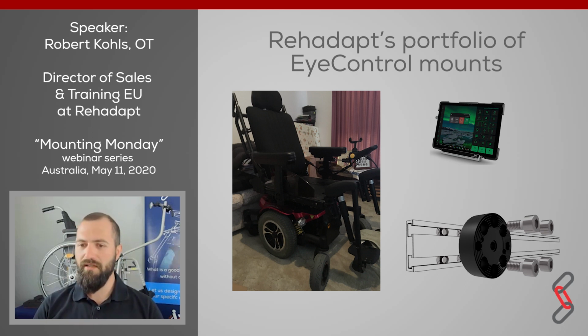We have here a Monty 3D Unitrack frame clamp that can be very easily attached to the wheelchair. Write it into the chat if you have an answer. If you have no answer for that question, I'll tell you what I would choose.